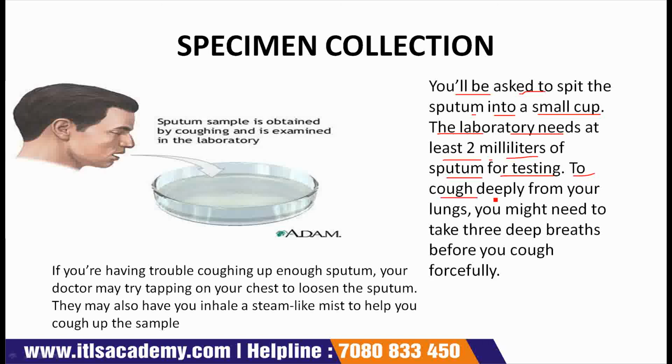To cough deeply from your lungs, you might need to take 3 deep breaths before you cough forcefully. Sometimes drinking plenty of fluids can help loosen the secretions and make it easier to cough up sputum.